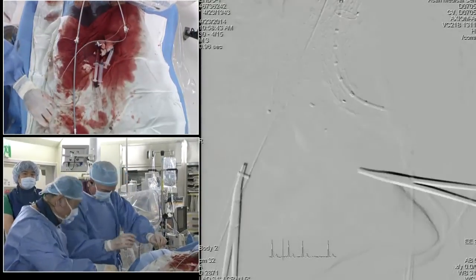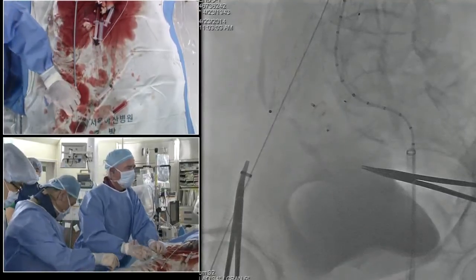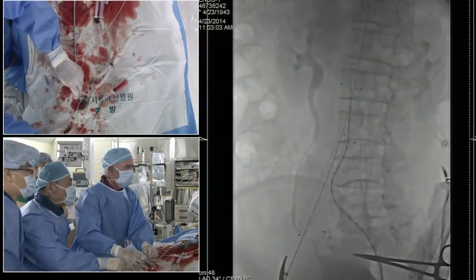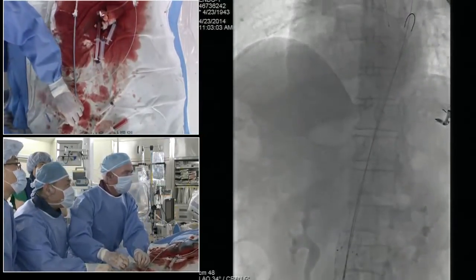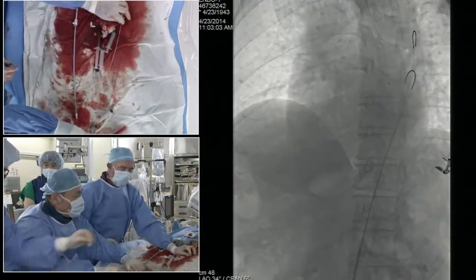John, Lawrence here. Hey, Lawrence. So you think this is coming in from below, right? I mean, it seems like that's the site. It's my best guess, but the other thing we'll do is dilate the junction between the main body and the left limb while we're there, so we can come out with a pigtail.